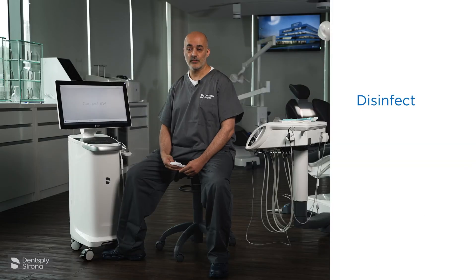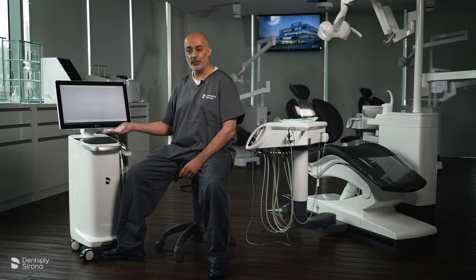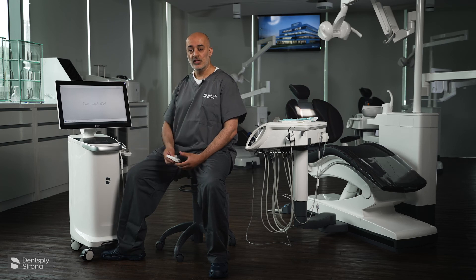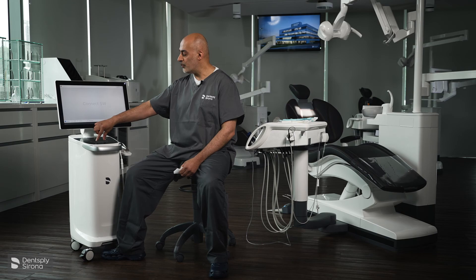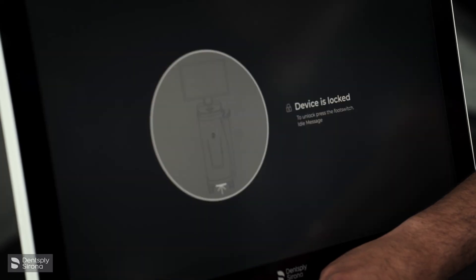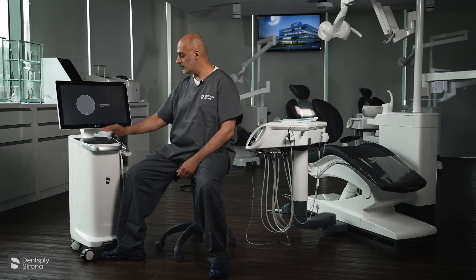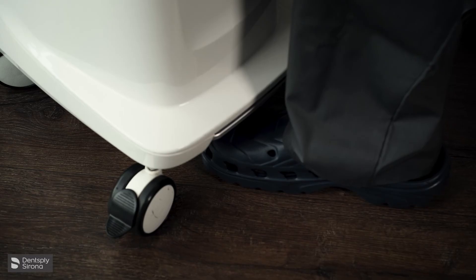The disinfection protocol is very simple and easy. There are three elements that need to be disinfected in between patients: the touch screen, the trackpad, and the camera. To lock the touch screen to allow you to wipe it down, press both mouse buttons and hold until the device is locked. You can then continue to wipe, and then use the foot switch to deactivate.